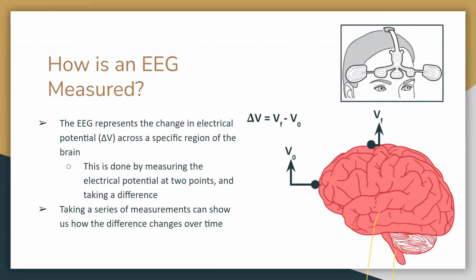As I mentioned before, this is more a section about exactly what the data is meant to represent in a clinical setting now. So here I already mentioned the subtraction and the electrical potential. So we're plotting the difference. And particularly this image in the top right is probably something you've seen from the Masimo user manual.